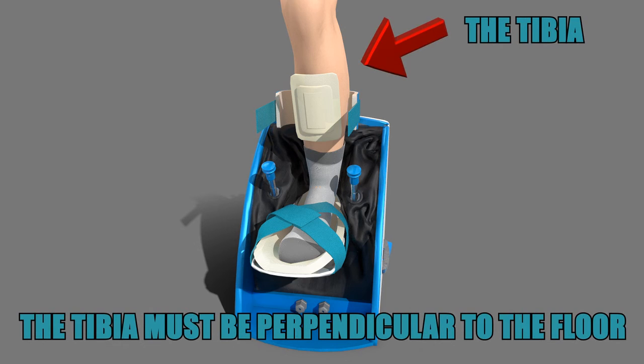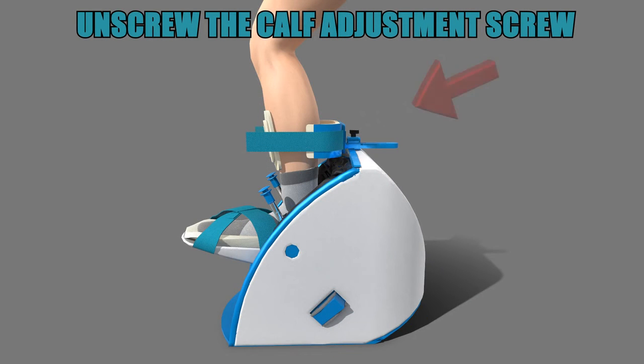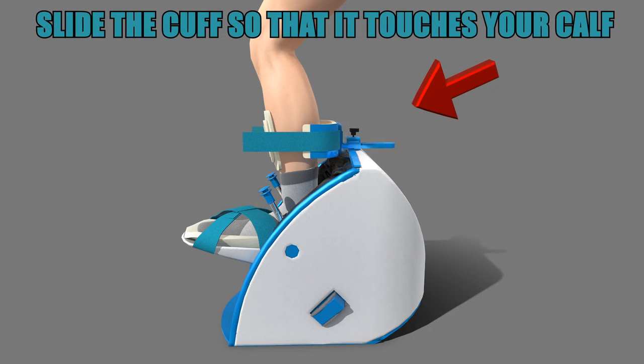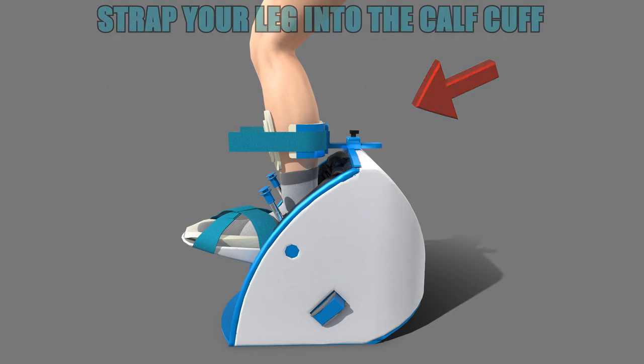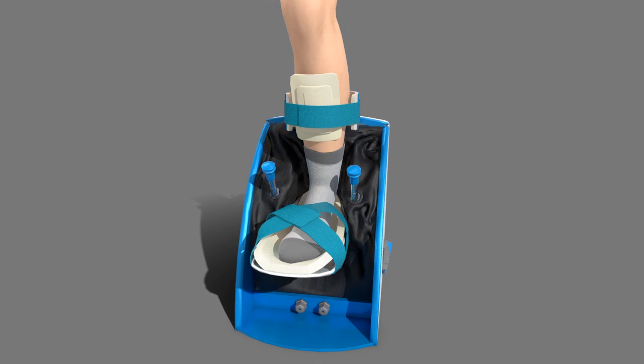Now we must line up your tibia to be perpendicular to the floor. To do this, unscrew the calf adjustment screw. Then move the calf cuff forward or back until your tibia is perpendicular to the floor. Once this is done, you will tighten the calf adjustment screw and then use the blue straps to strap in the leg.